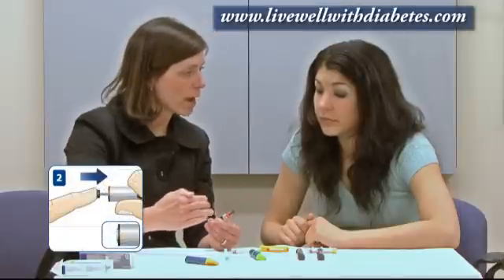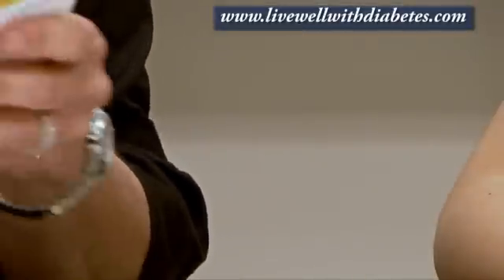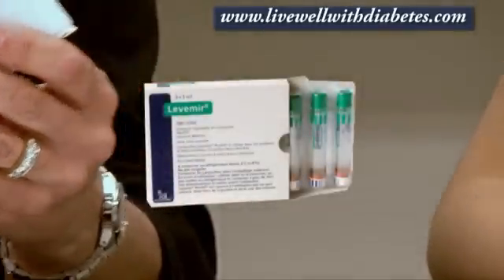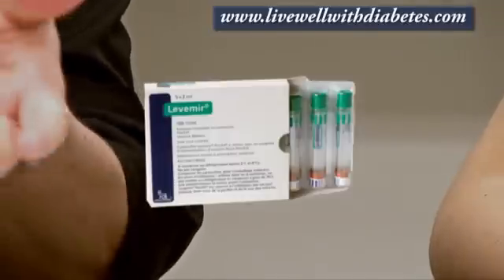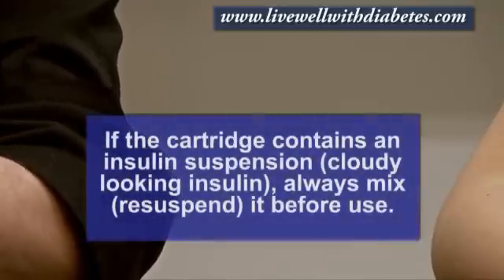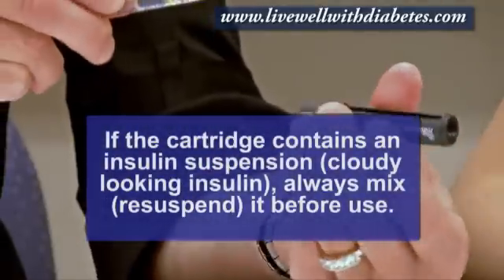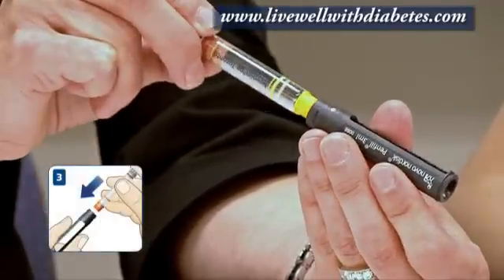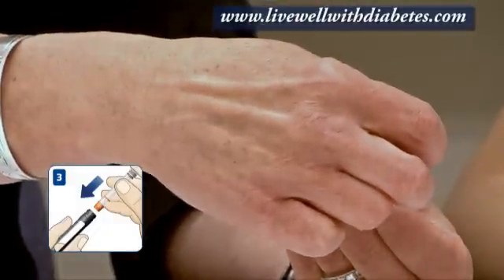You have to retract the piston to its starting position. Then you get a tube of insulin. Each tube of insulin comes in a box, and in each box there are five cartridges — they're called tubes or cartridges. Take one of the cartridges out; it fits into the black section. The yellow end fits in first, and when you put it in the right way, you'll see the yellow end come out the other end.